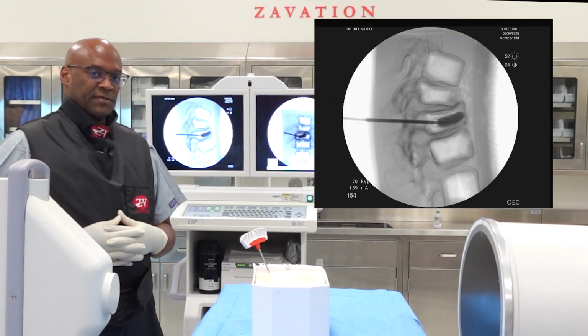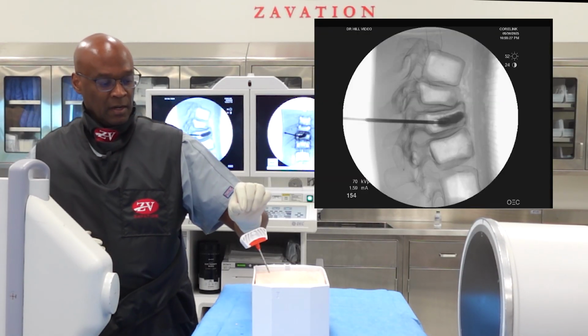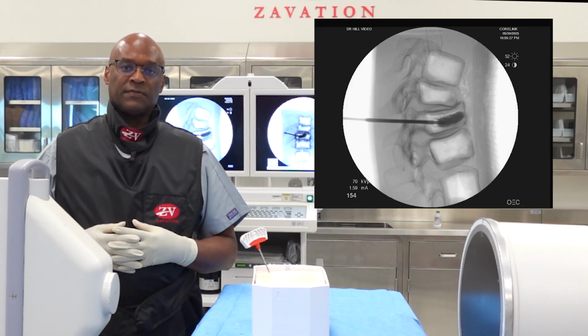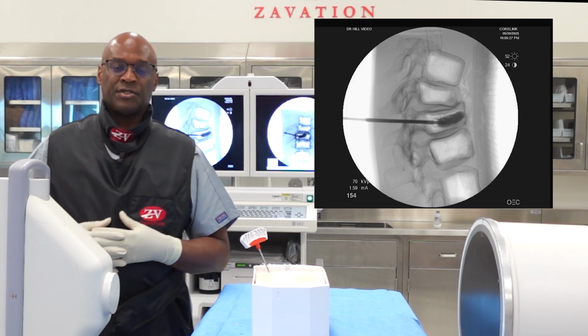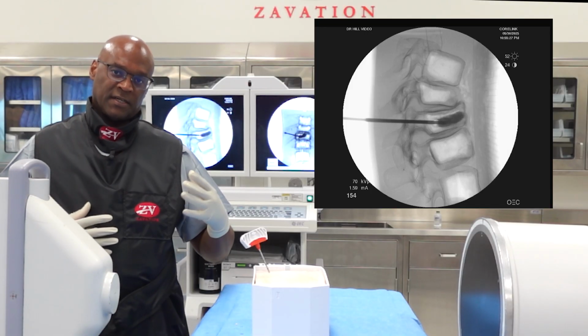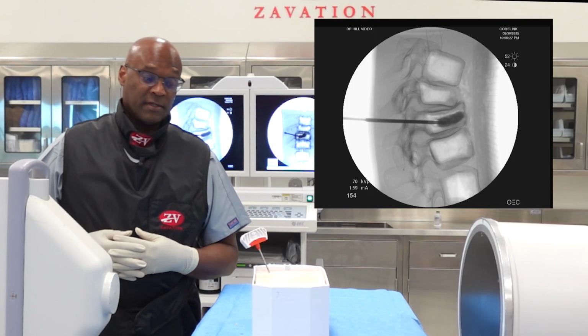Once you've infused the cement into the vertebral body, I normally put the inner trocar, the jamshidi, back in place and wait a couple of minutes for the cement to set. This prevents a tail of cement coming out through the pedicle, or if there's a breach in the pedicle or near the pedicle, it'll prevent extravasation of the cement into places that you do not want it to go.